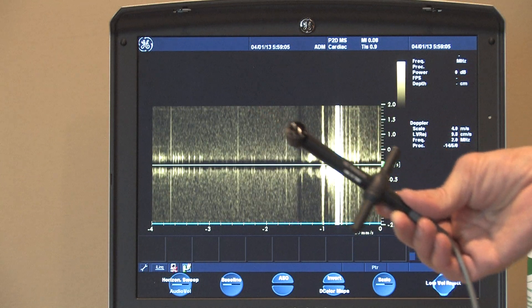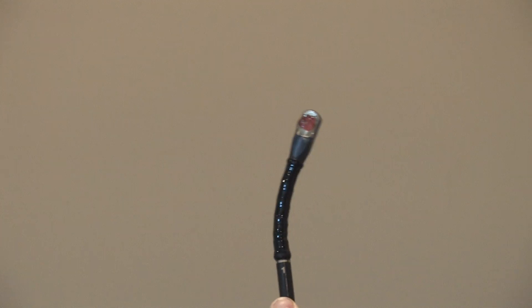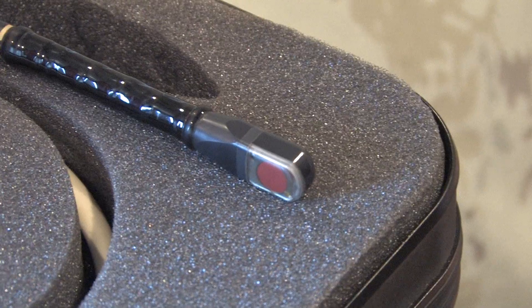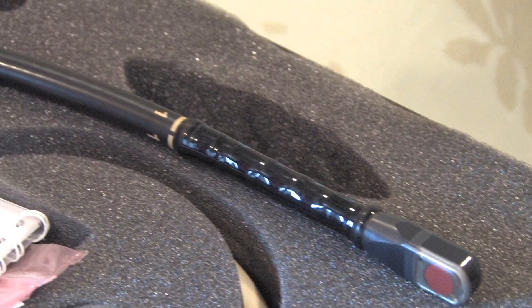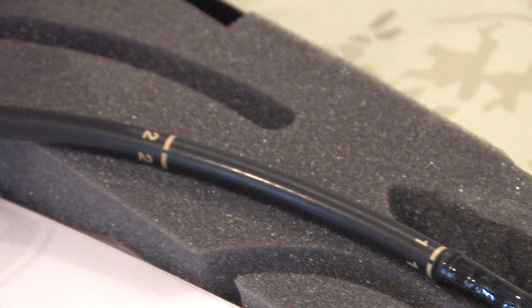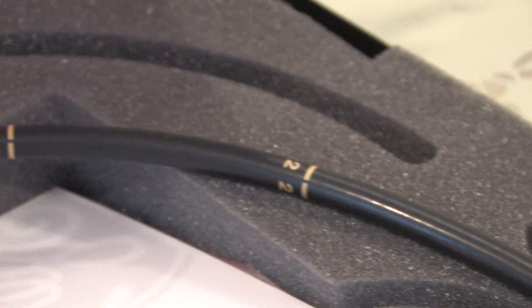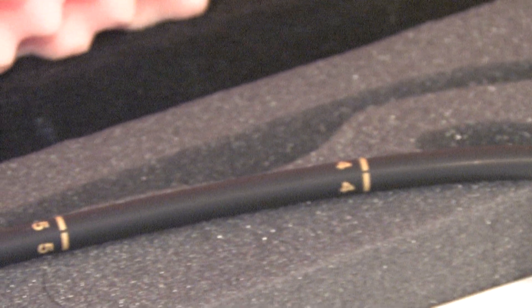There's the PEDOF non-imaging P2D probe. This is the TEE probe, and I'll demonstrate that it is mechanically intact. Its crystal is also fine. It rotates fully through its cycle. Its image is fine with no dead imaging lines or anything like that — it's in great shape. I'm panning through the whole probe so you can see there are no bite marks or damage of any kind.